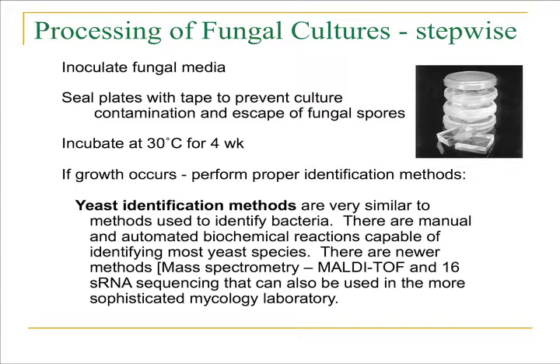If growth occurs, the proper identification tests need to be done, depending on whether it is a yeast or a mold. Yeast identification methods are somewhat similar to bacterial methods. The most common methods used in mycology laboratories are manual and automated biochemical reactions, and they formulate a biochemical pattern that can be used to identify the yeast.